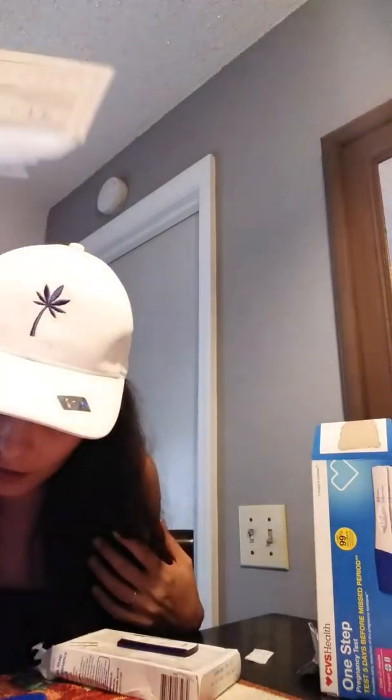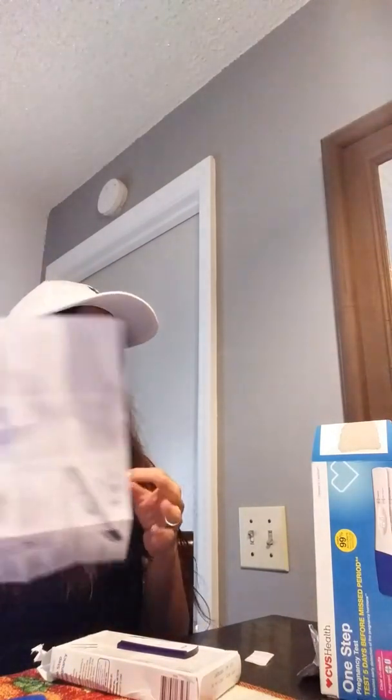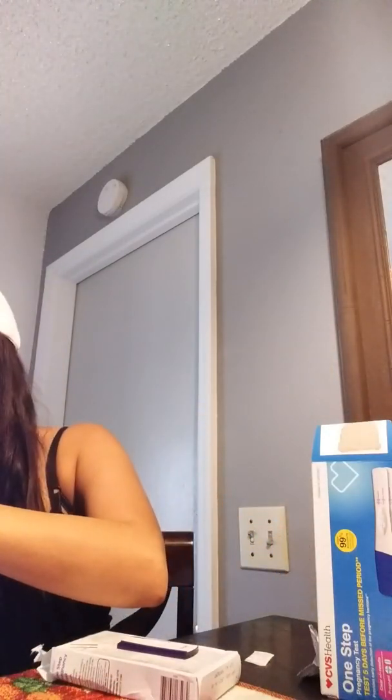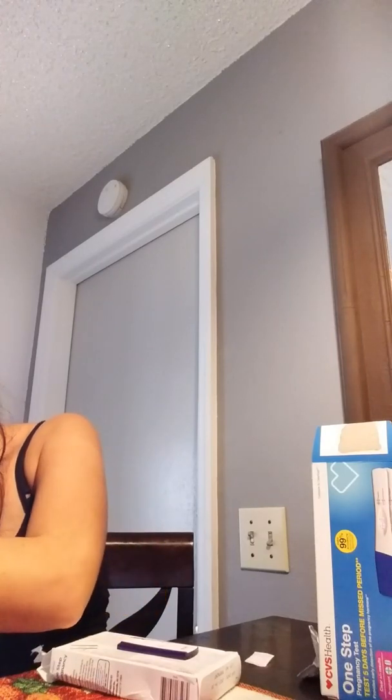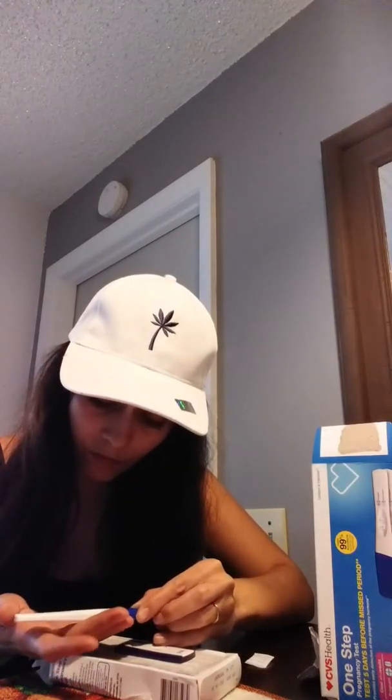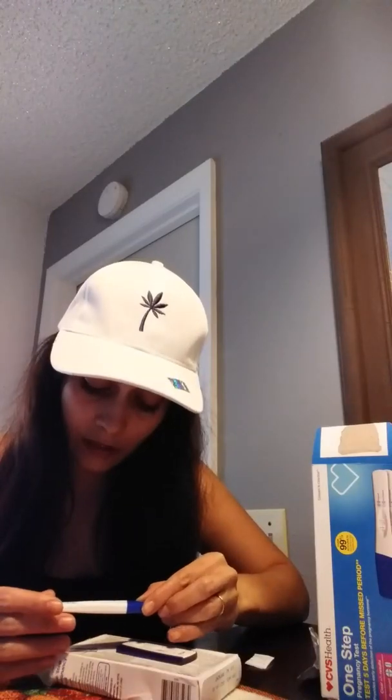There's a line. Let me cover it real quick to get the glare out of it. This is crazy. Okay, it's been two minutes — I can lift it. I see a line. Oh my god. Hold on you guys, because I feel like it's still forming.